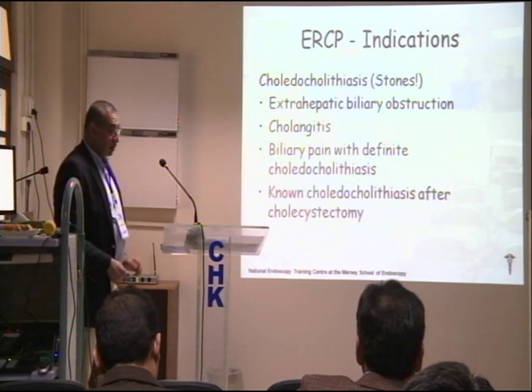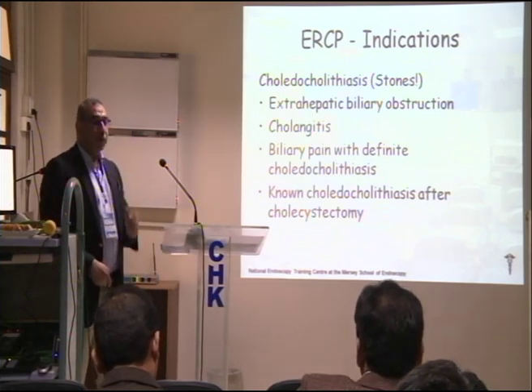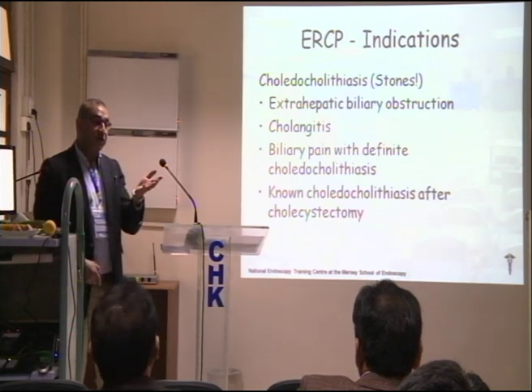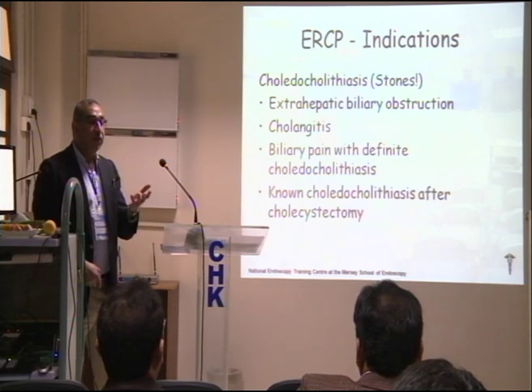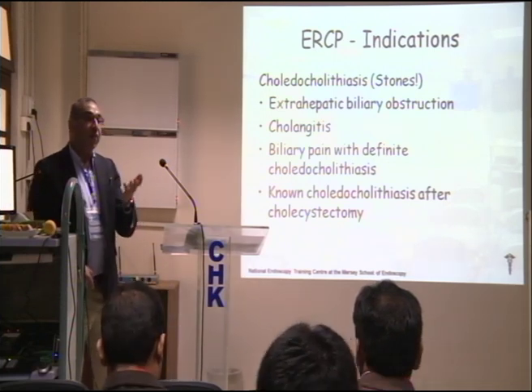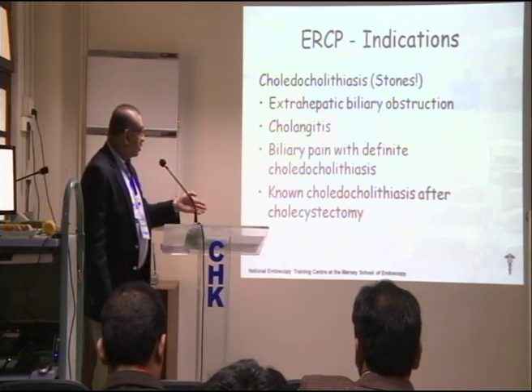Also, we can do it in sphincter of Oddi dysfunction. Yes, but that again is therapeutic intent. You don't do ERCP for sphincter of Oddi dysfunction to diagnose it. You diagnose it either on the basis of your clinical and biochemical reasons or by doing manometry studies. You do ERCP to do a sphincterotomy.